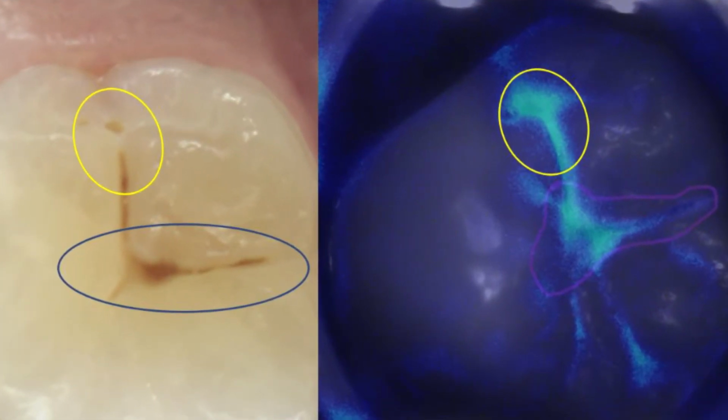Then we imaged, and what we find is that yes, in the area the dentist had pointed out, there is active demineralisation, but it's far more extensive than the dentist felt it was. In this example, we can see areas of luminescence indicating demineralisation beyond the area where the dentist was concerned.